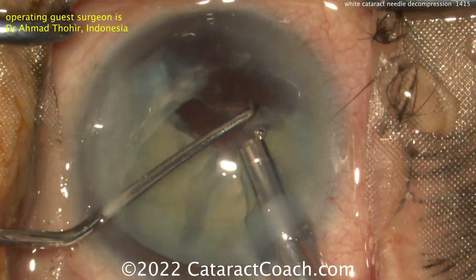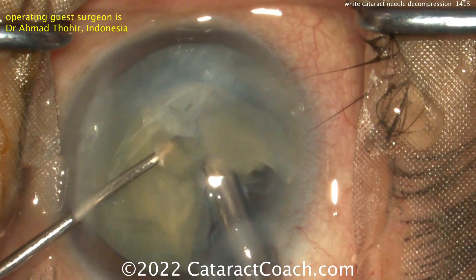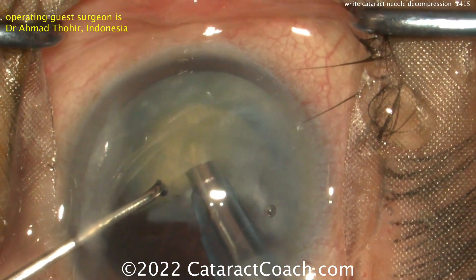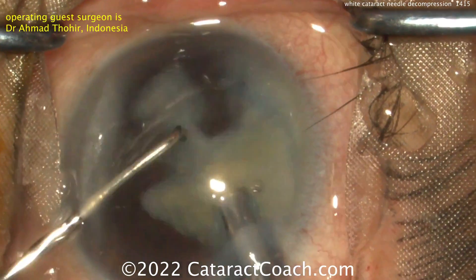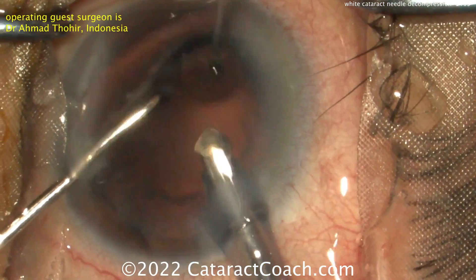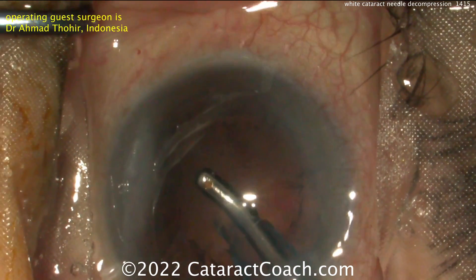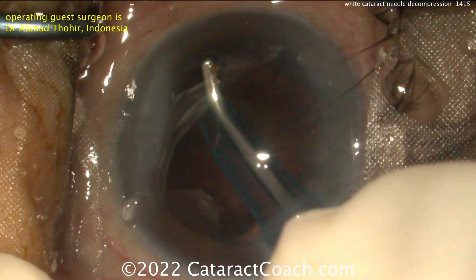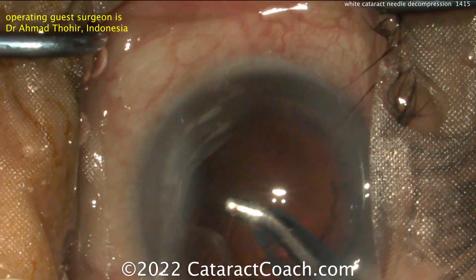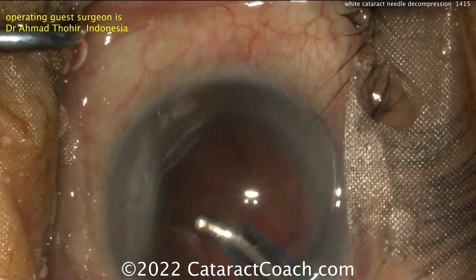Definitely use the technique of needle decompression. You want to use a small gauge — 27-gauge needle would be great; you could do 25 or 30 gauge, but 27 is the sweet spot. Use a 3 cc syringe, fill it halfway — about 1.5 cc of balanced salt solution. Poke it in bevel down, then immediately aspirate and get that liquefied lens material out. Then rock the nucleus so you get that posterior liquefied cortex to come around the equator of the lens nucleus, and aspirate that too, to fully depressurize the capsular bag.